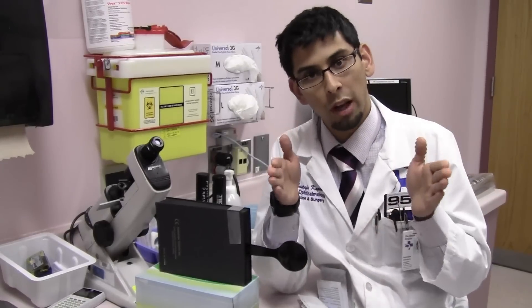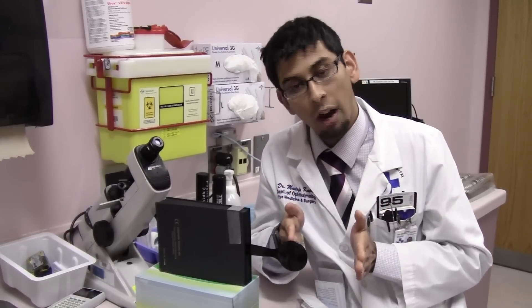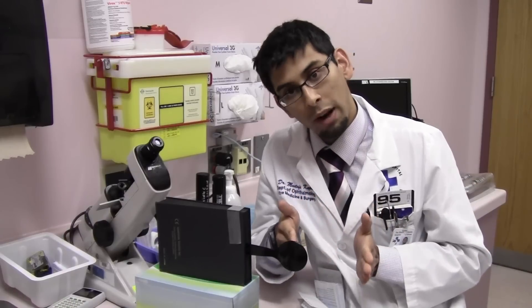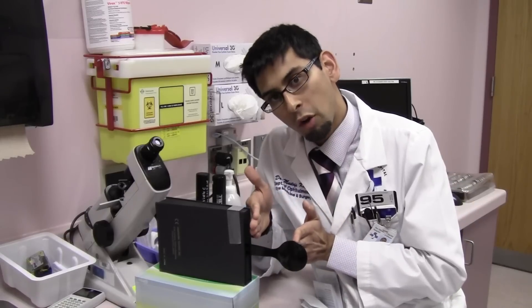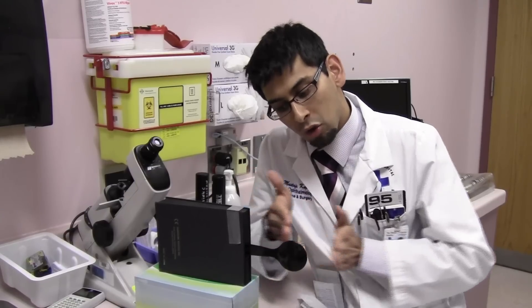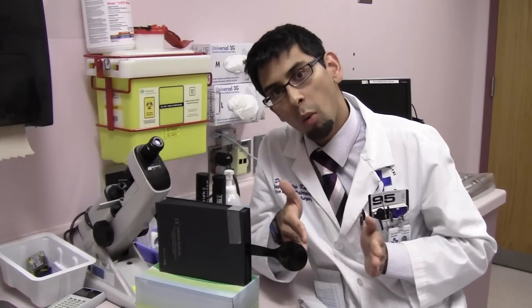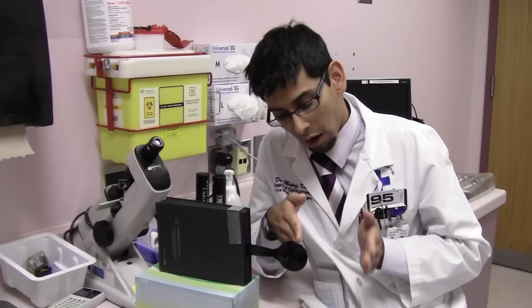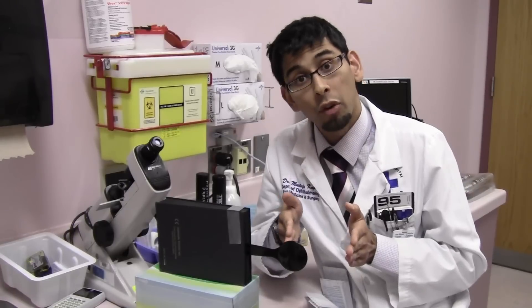So how is this going to work? Let's look at a patient again in ortho. Both eyes are aligned — you're going to cover one eye. Then, instead of uncovering that eye, you're going to alternate cover: move the cover straight over to the other eye and straight back to the other eye, so there is never a moment where one eye is not covered. The occluder is always in front of one of the eyes.